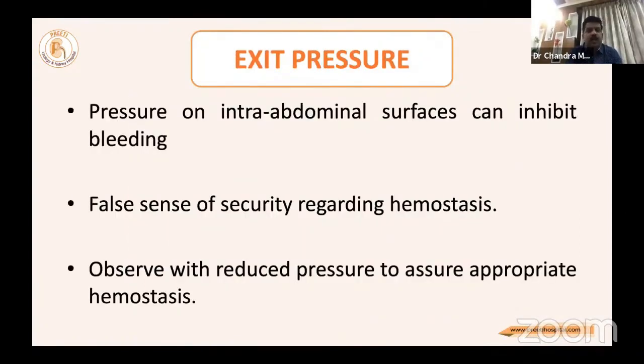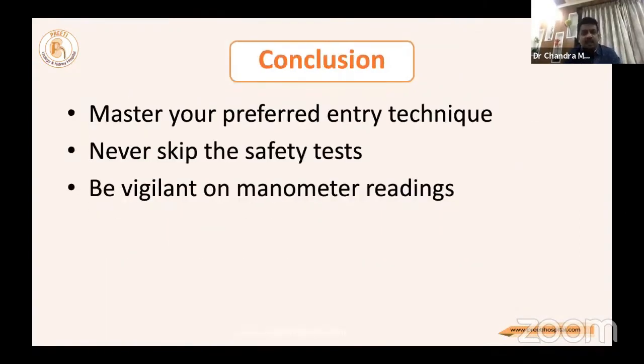So with that, I conclude: master your preferred entry technique. Never skip the safety test. Be vigilant on manometer readings.